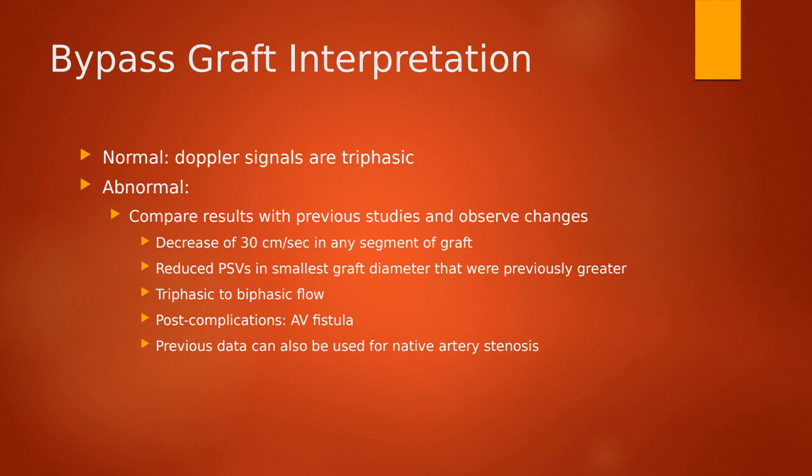Now, a lot of these patients are going to be coming in for routine follow-ups if they have a bypass graft. So we may see them every 6 months, every year, maybe every 2 years. We definitely see them if they have to get their graft replaced at any point. Grafts don't last forever, so sometimes we have to go in and replace them. So really, we're seeing these patients quite a bit. When we're looking at these, we want to make sure that we have as many priors as possible, and we're really looking to see if there are any changes, especially in those waveforms and those velocities.